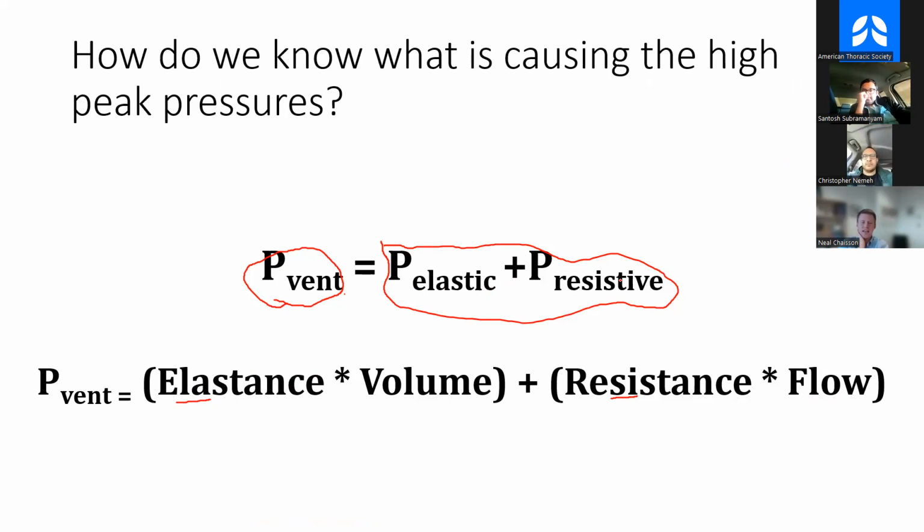You guys just did it in your last case, right? Calculating the plateau. The difference between plateau and PEEP pressure. Say it again, Sergio. Oh, sorry. Calculating the difference between the peak pressure and the plateau pressure. Good. So the plateau pressure.